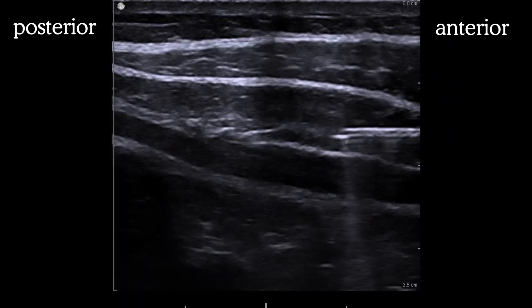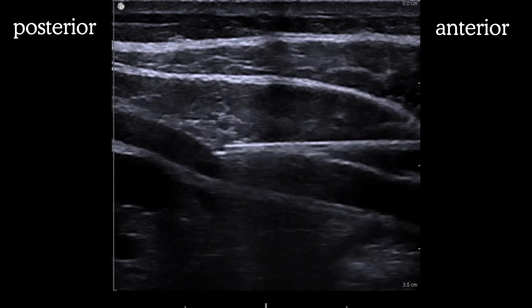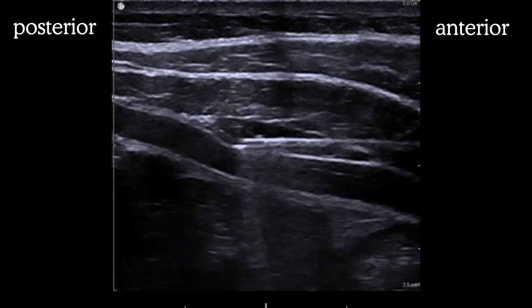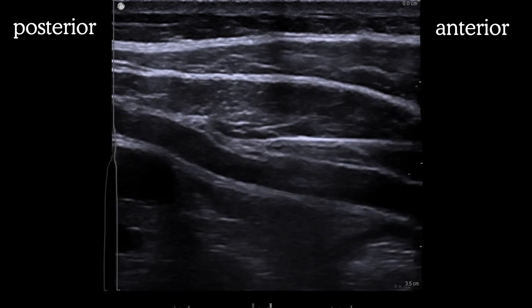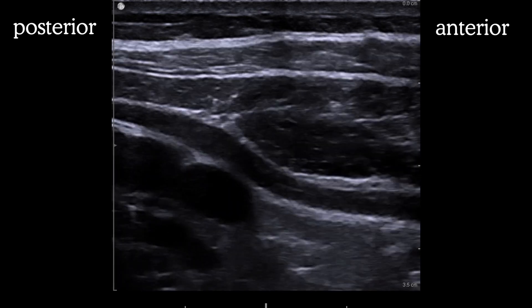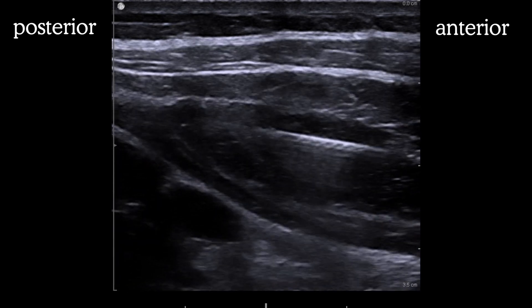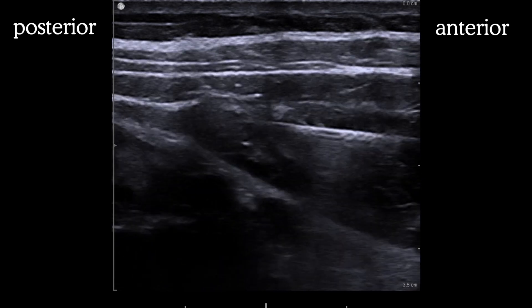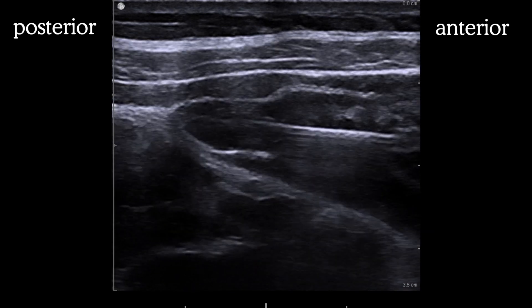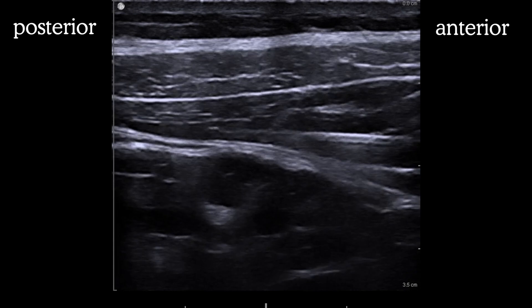Here we see the needle approaching from the anterior aspect, located within the internal oblique muscle. The needle tip enters the TAP plane, and a small test injection of saline confirms we're in the right location. We then switch to local anesthetic and continue to inject. The needle is continually advanced within the dissected plane in order to leverage hydraulic force to unzipper the two muscles. As the needle is advanced, we move the probe in the same posterior direction to keep the tip on screen. We've now reached the end of the transversus abdominis, which is our goal for injection. Once finished, the needle is removed and the block is repeated on the contralateral side.